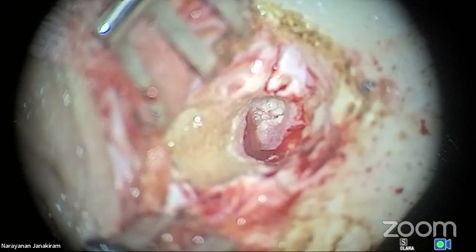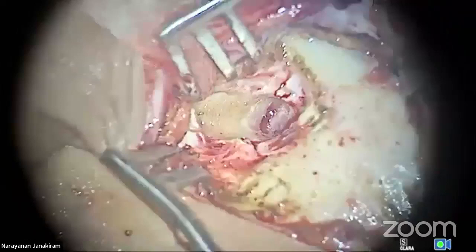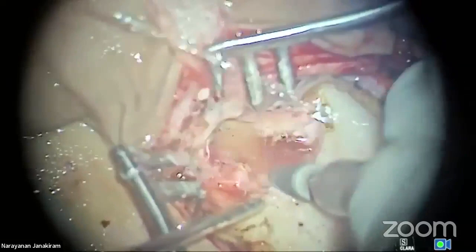Now, what am I going to do? I'm going to start the C technique. I have gone on telling about the C technique many, many times. Now, how do you start the C technique? It starts from the 12 o'clock position with a conical bar. You can see it starts from here, ends here. So the sweep is a single direction sweep.